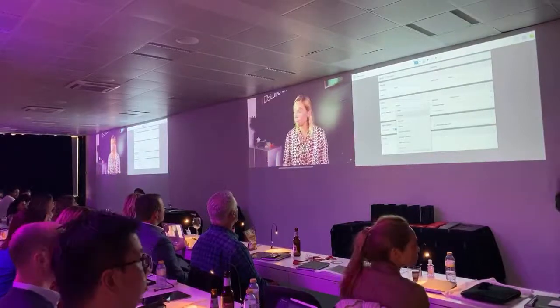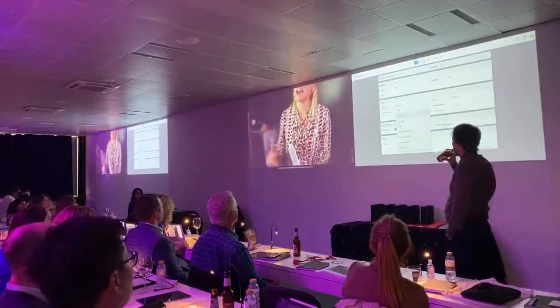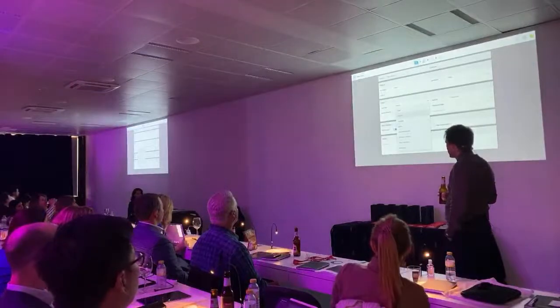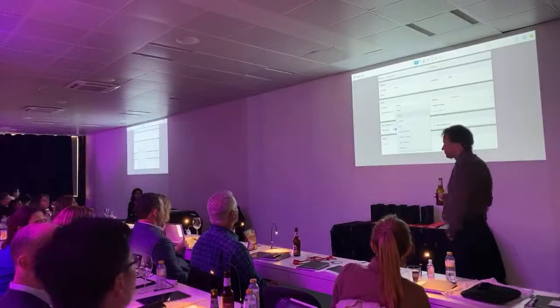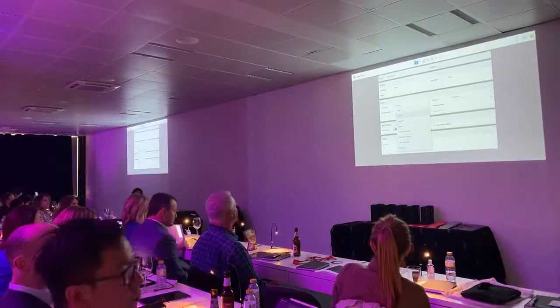Okay, show the tricks. Yes, so here, the first case, we're going to have full arch preps for veneers. And here in the screen of the iTero, you will be able to choose between chair-side milling or restorative solution.